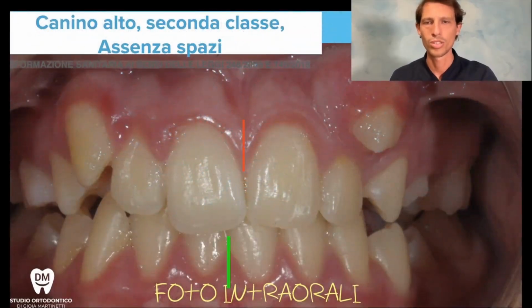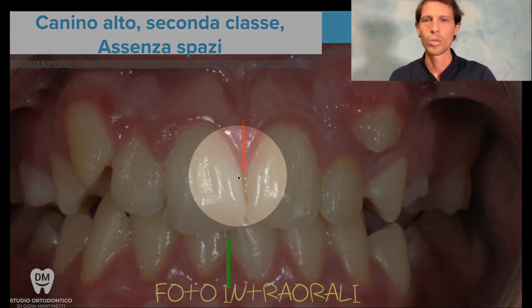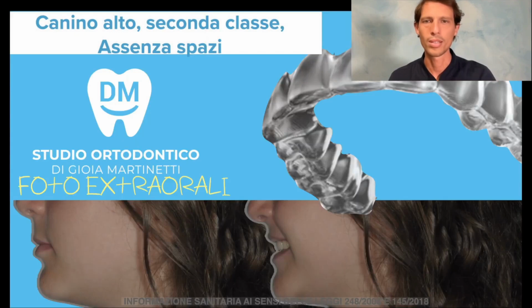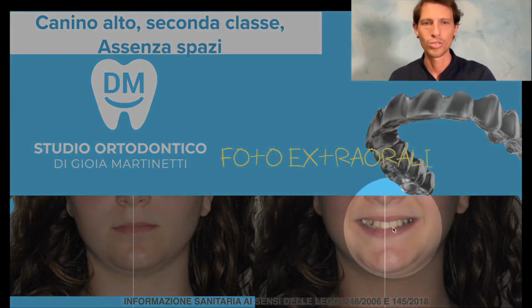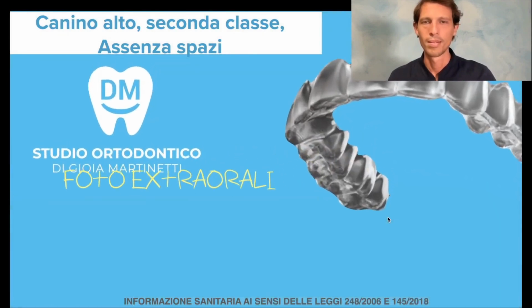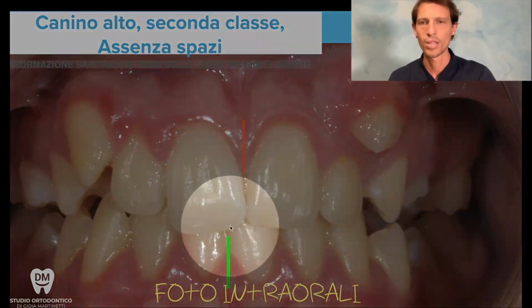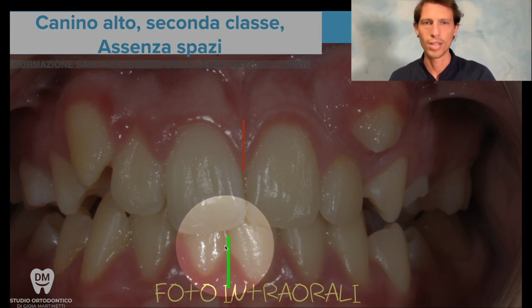This is the initial situation, where you can see a deviation of the midlines, that is, the upper one. We said it is shifted all to the patient's left. You see everything is shifted to the patient's left. While we are looking at the screen, of course, it's on the right, but for the patient, it's on the left. So the lower part is the correct one.